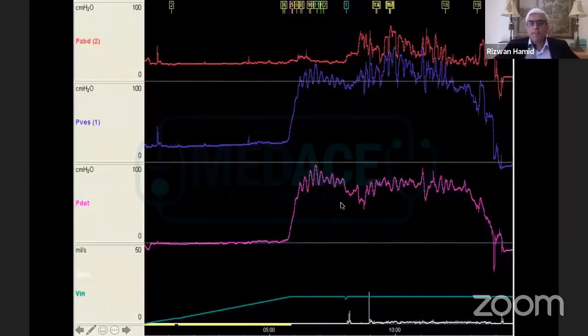So this is the urodynamic trace in that patient. Again, remember I said that urodynamics is pattern recognition. So there are various patterns, like in radiology, various patterns come up and then we go by that. So this is a classical trace of a suprasacral spinal cord injury, where we have got a classical sawtooth appearance because of detrusor sphincter dyssynergia.